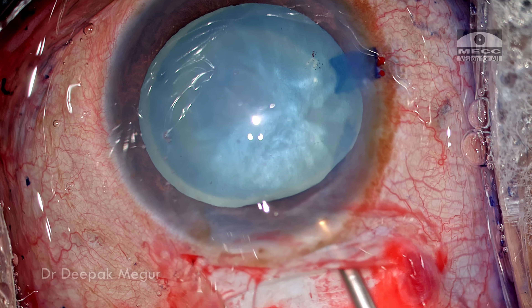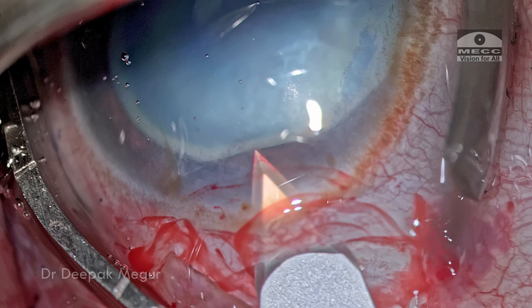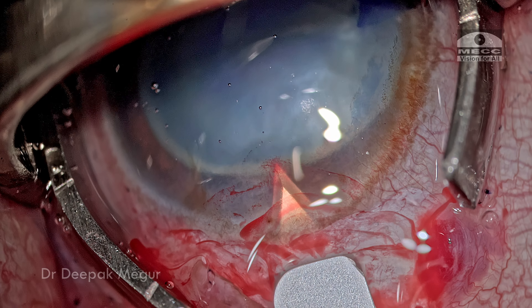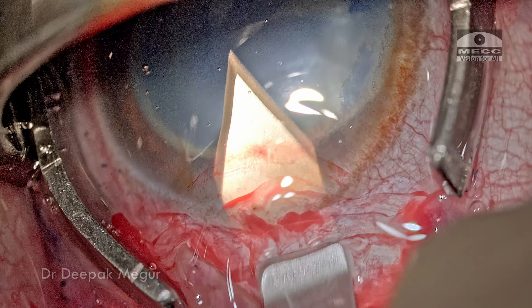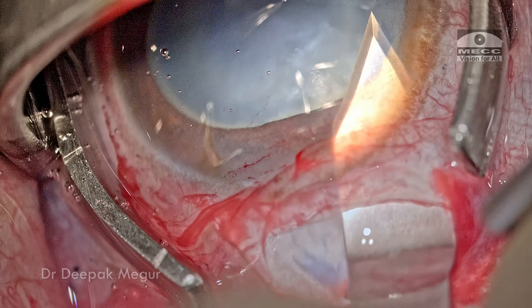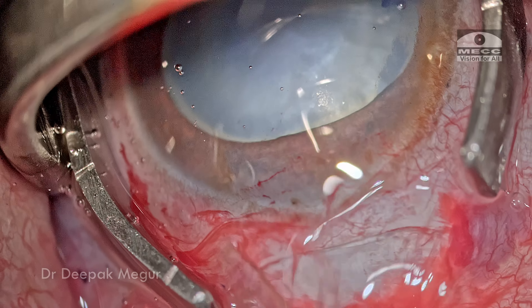With the anterior chamber pressurized with OVD, I'm going to enter through the main wound and create the internal incision. I'm going to use a 2.8 millimeter bivalved sharp keratome. I enter in the central part and then extend it laterally on either side, so the internal entry would be 0.5 to 1 millimeter longer than the external scleral incision.